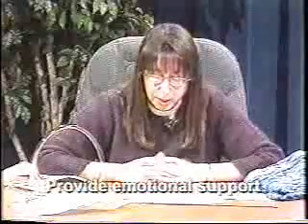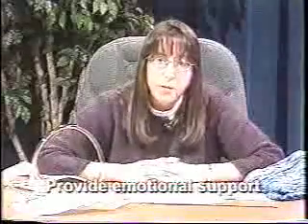Let us now go over the principles of catheter care. Providing emotional support is very important for people who have urinary catheters. The patient may be embarrassed to have a tube draining their urine in the view of others. To help the patient maintain dignity, the drainage bag has a cloth cover placed over it.